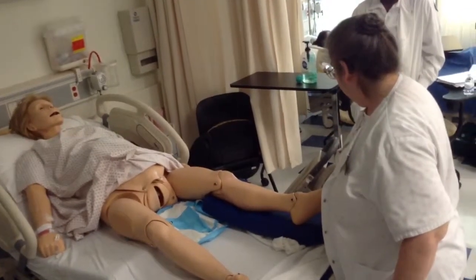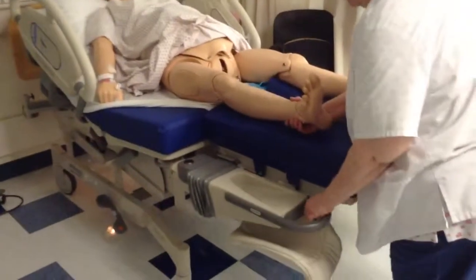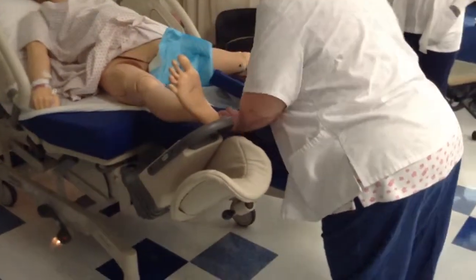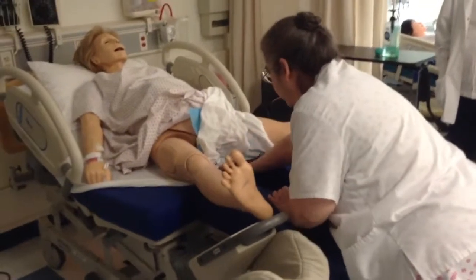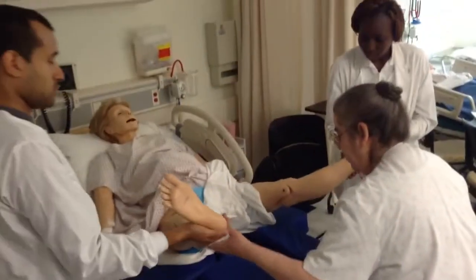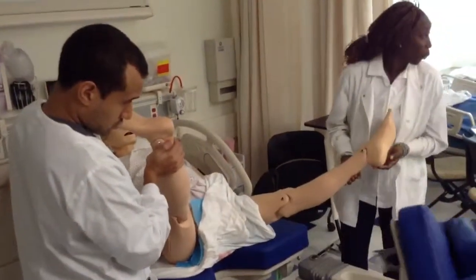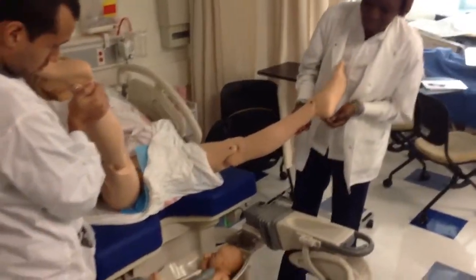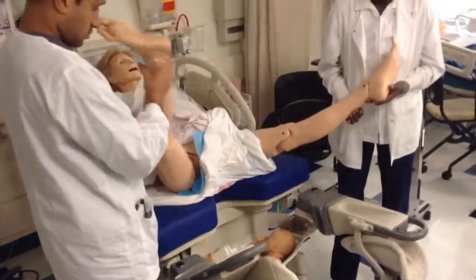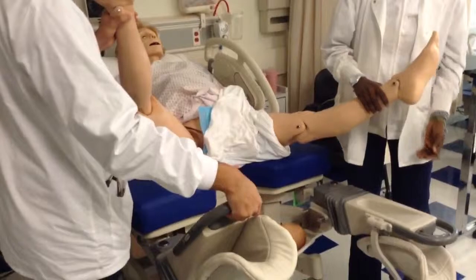Okay? These are very rarely used, they form stirrups. I'll show you those in a minute. You get both legs out, both feet up, the patient goes out, and then underneath here is where the bed is. Okay? And what you're going to do, and somebody hold these legs here, you reach in and you take hold of the head, just hold the side there. Straight up and back out. And there's the baby. And that's how delivery works. Well, when we come to our scenarios, we push the baby that's in her tummy out, then we hand you the baby that's down there. Because the one that's in her tummy is extremely scrawny.